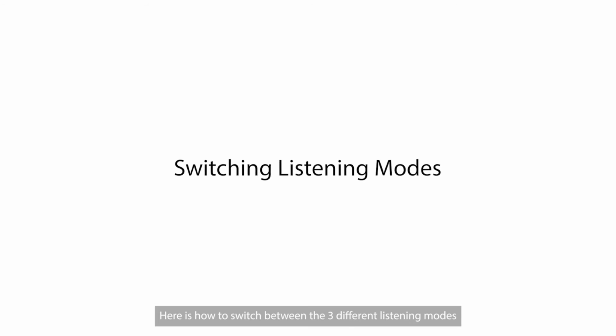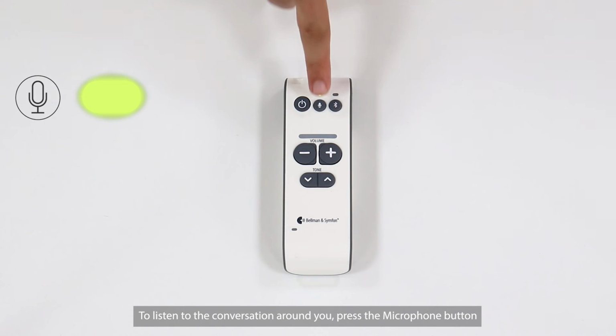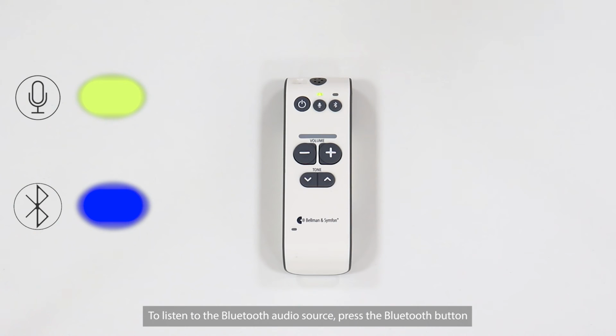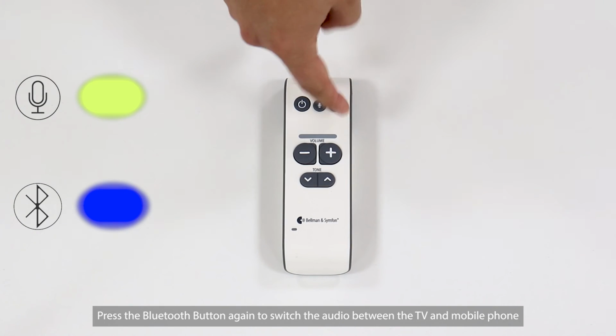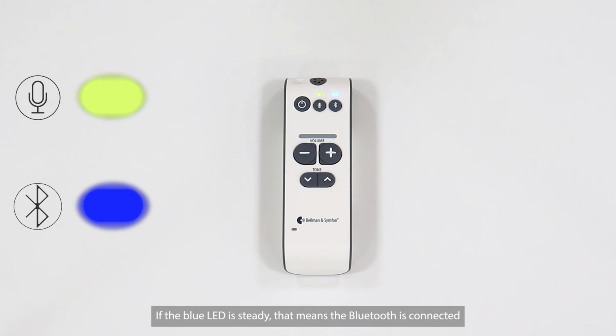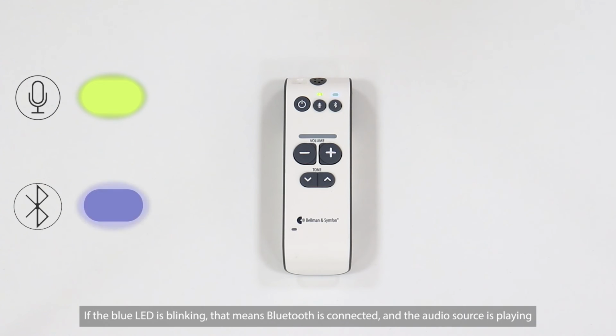Here is how to switch between the 3 different listening modes. To listen to the conversation around you, press the microphone button. The green LED is on, which means the internal mic is active. To listen to the Bluetooth audio source, press the Bluetooth button. Press the Bluetooth button again to switch the audio between TV and mobile phone. If the blue LED is steady, that means the Bluetooth is connected, but the audio source isn't playing. If the blue LED is blinking, that means the Bluetooth is connected and the audio source is playing.